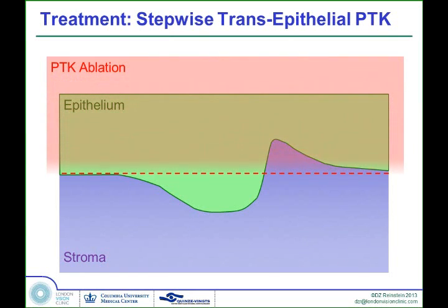And then what we would suggest you could do, and this is your judgment, is that you do your 55. Just don't stop. Just hit the pedal and go all the way down 55. Stop and look at the breakthrough pattern. And think, I haven't really got very far here. It's a lot less than you expected. The bump hasn't even been exposed.